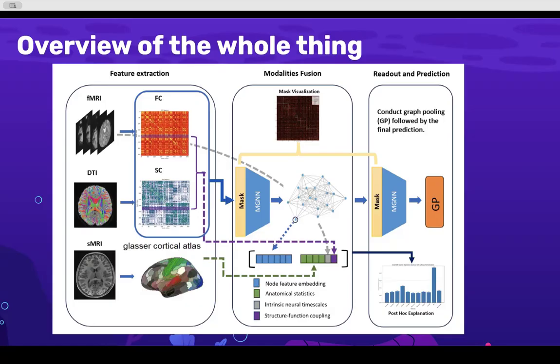You know how DTI works? Diffusion tensor imaging. Basically it measures the diffusion of water molecules or protons, in which direction they move. You can see the concentration change, and then you can see, okay, in this little cubicle, they're moving more readily. The diffusion movement is happening more readily across this direction than that direction. That means there's a myelinated axon sheath there that prevents diffusion across and favors diffusion along it. In each little space, we measure directions of movement.